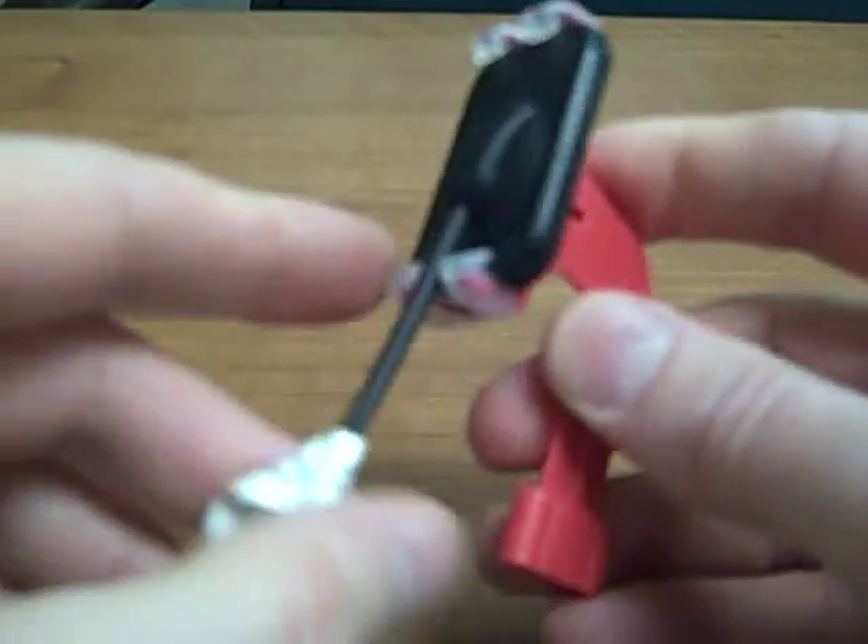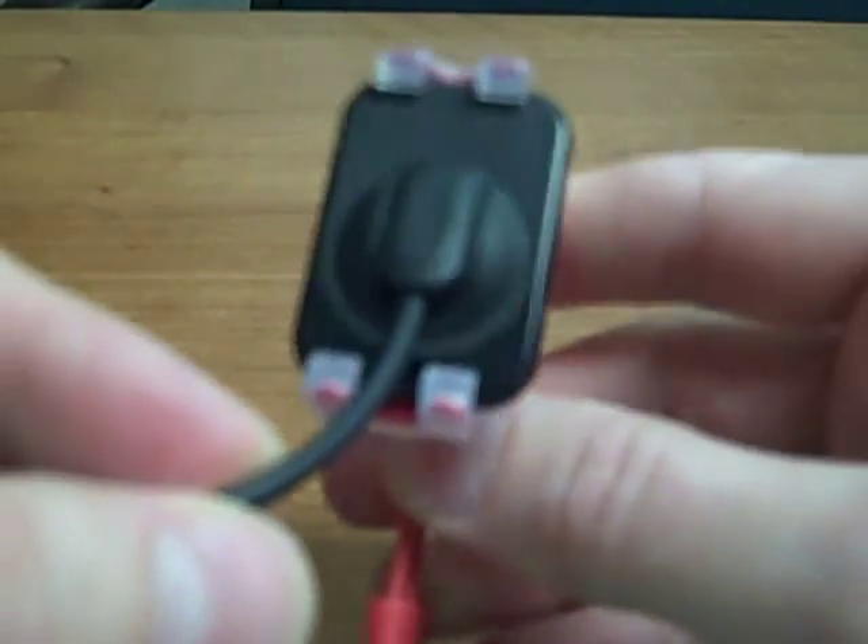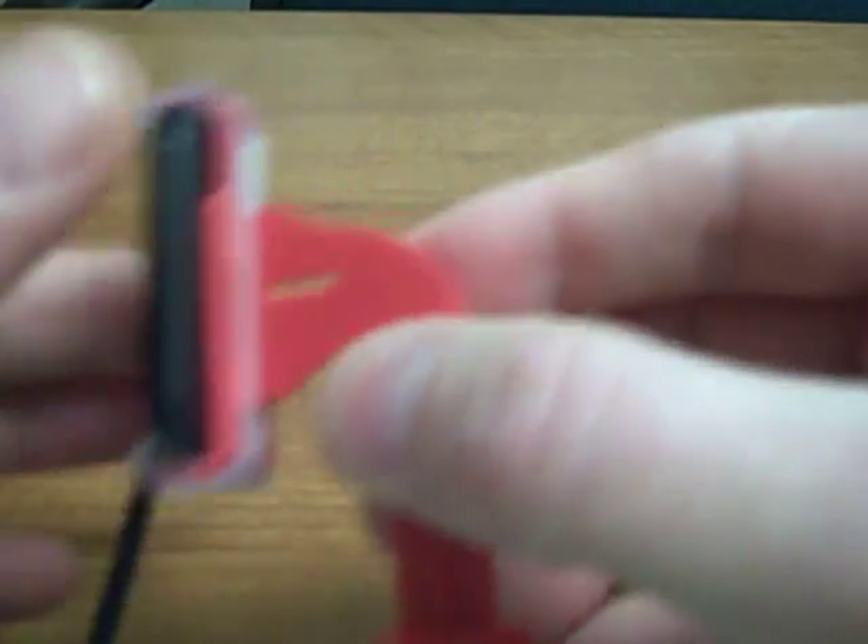One of the nice things about this design is that there is no tension placed around the cord at all. So you can see, you don't have to worry about your cord relief.